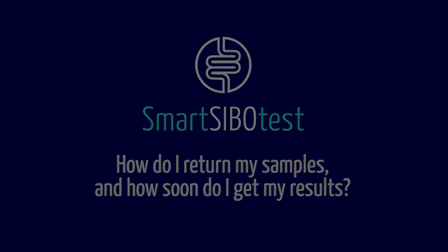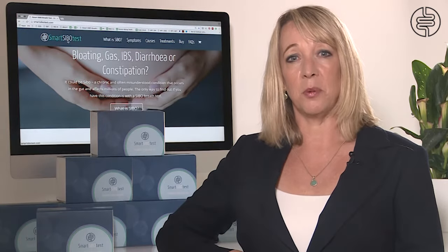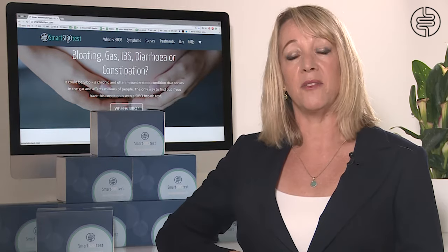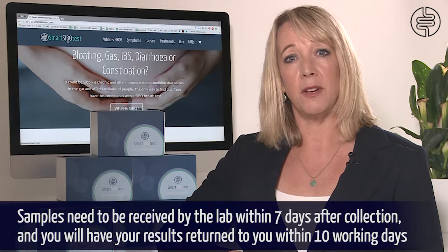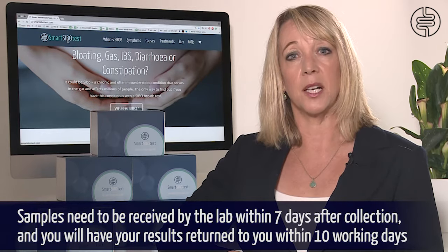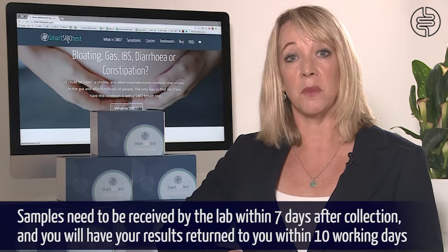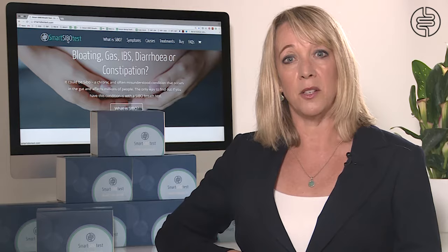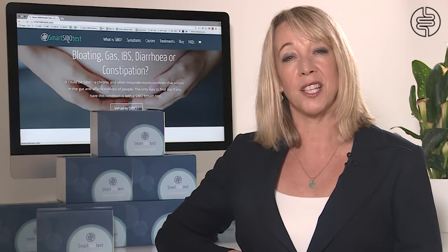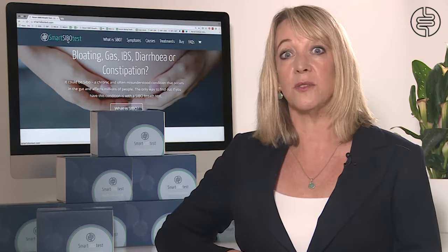After collecting all of your samples you will need to send them back to the lab. Postage labels and packaging are provided with the kit, but you will need to pay for the return postage. Samples should be received at the lab no later than seven days after the sample collection, and your results will be ready in 10 working days after they've been received by the lab. You will receive your results by email or post, whichever you opted for when ordering, and you will also receive an interpretation guide and a comment from us telling you if your results are positive or negative.